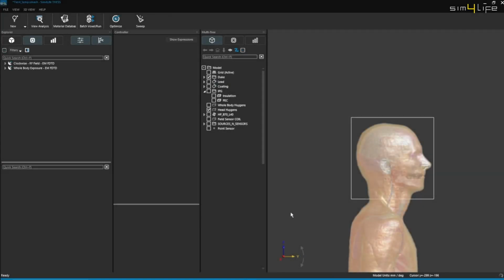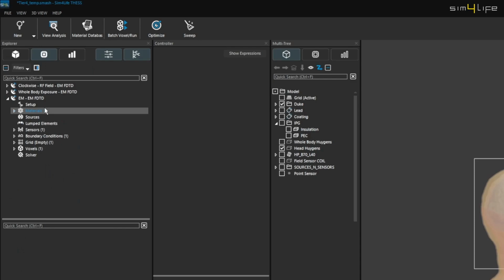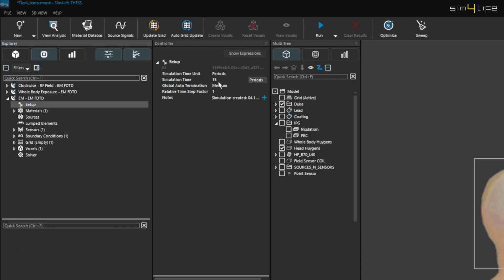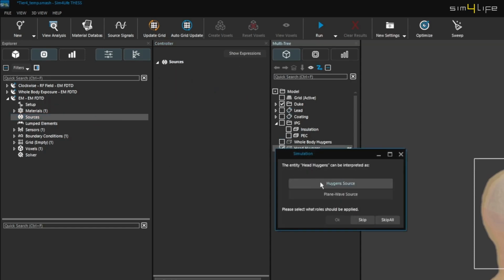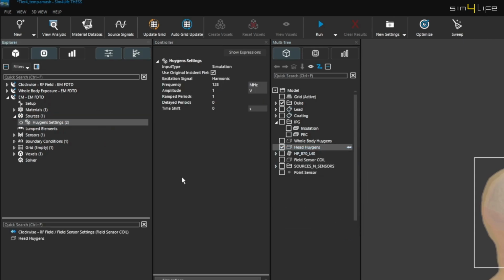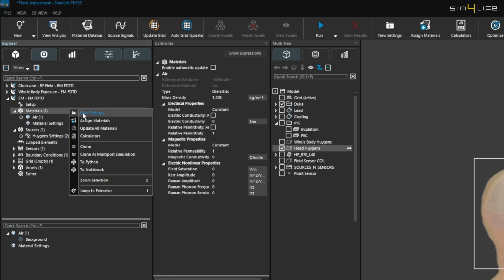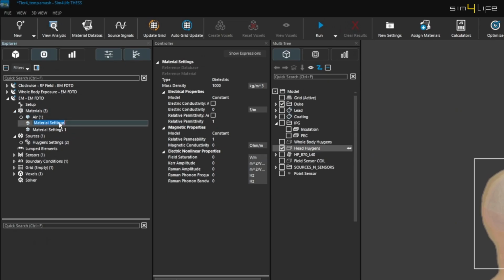Now we proceed to simulate the interaction between the MRI field and Duke, including the implant. For this step, we continue to use the Huygens principle, applying it specifically to the head Huygens box. We set up a new FDTD simulation with a runtime of 12 periods, and set up the Huygens source as previously. Later, we assign the material properties for the various components involved in the simulation.